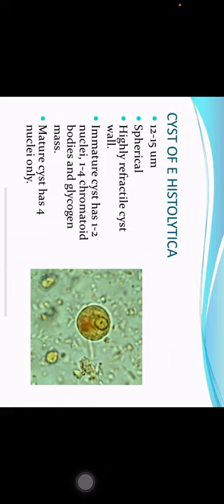Cyst of Entamoeba histolytica: about 12 to 15 micrometers in dimension, spherical in shape with a highly refractile cyst wall. The immature cyst has one to two nuclei, one to four chromatoid bodies, and a glycogen mass. The mature cyst has only four nuclei.